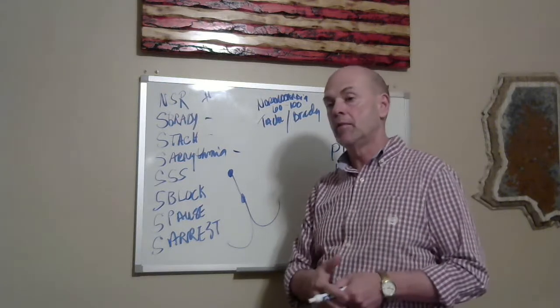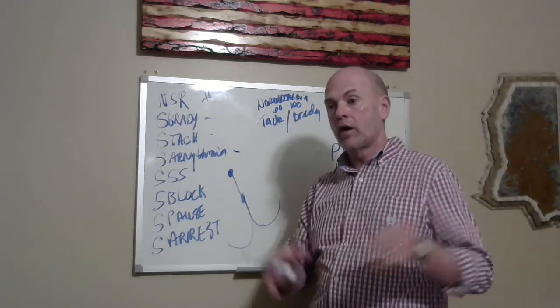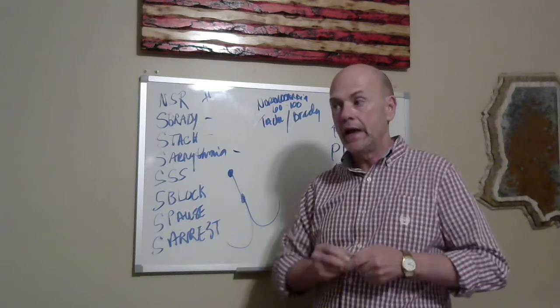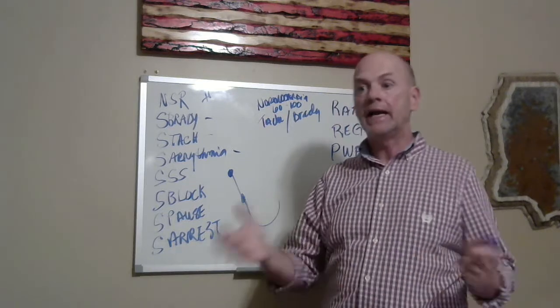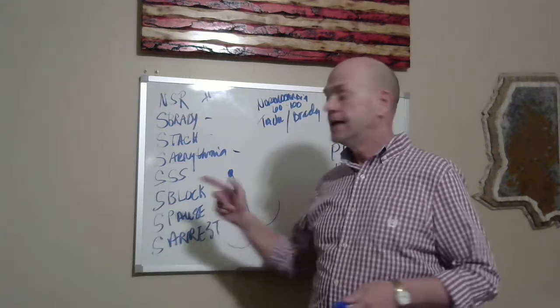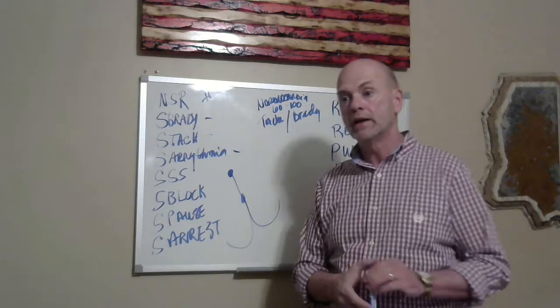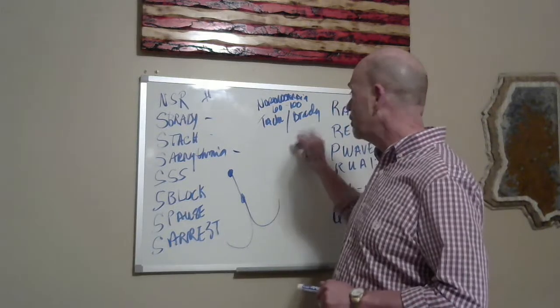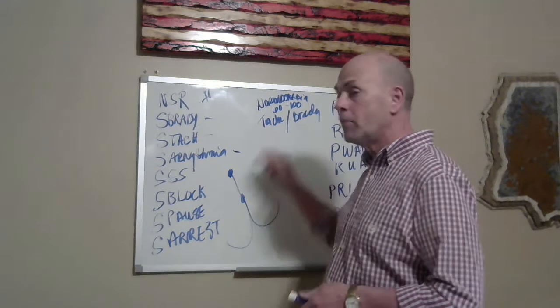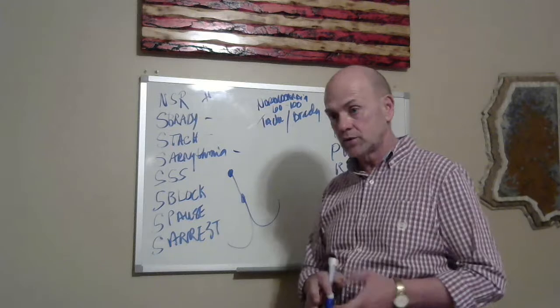We're going to see some periods of normal cardia. I may see several QRS complexes in a row, and I calculate the rate of 80 or 90. It might look like a normal sinus rhythm, but that sick SA node will quit firing at that rate of 60 to 100 and drop into a bradycardic range below 60. Or it may go above the tachycardic range, which is greater than 100 but less than or equal to 150.